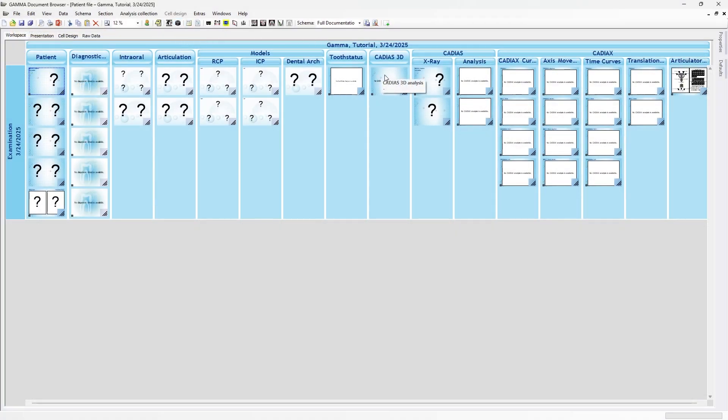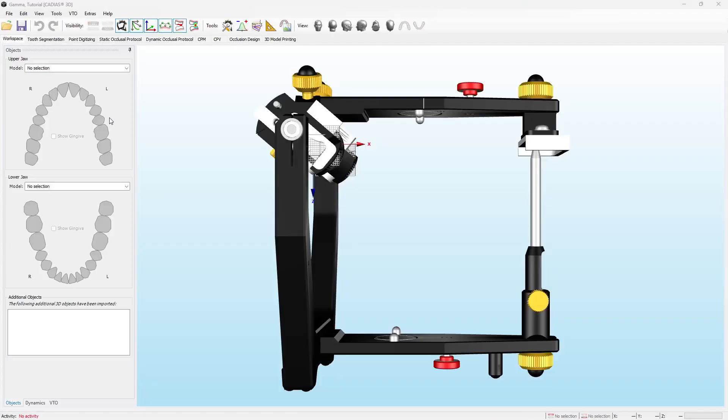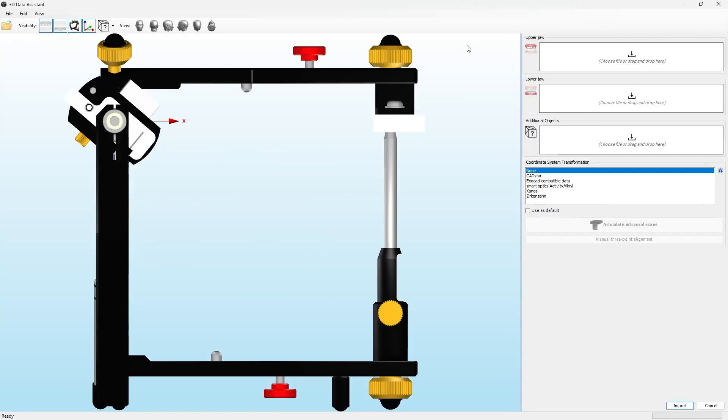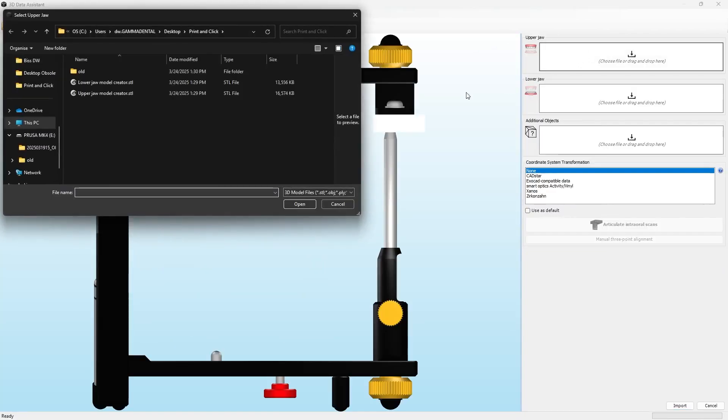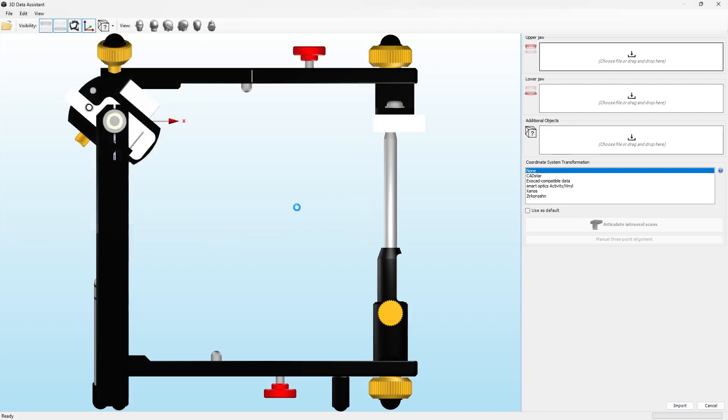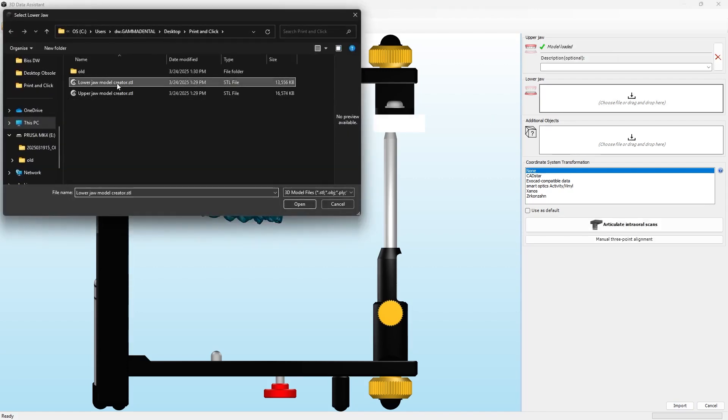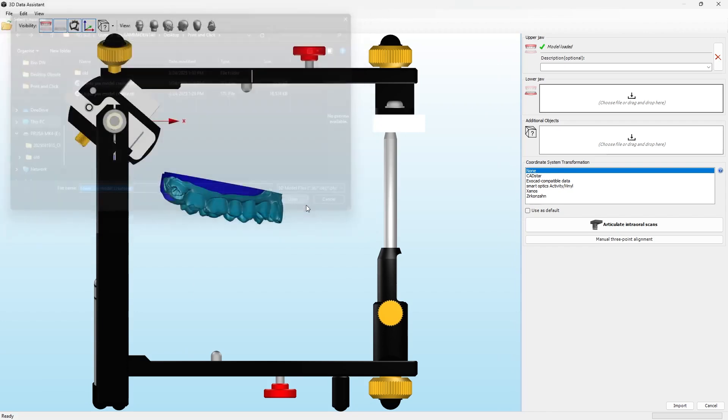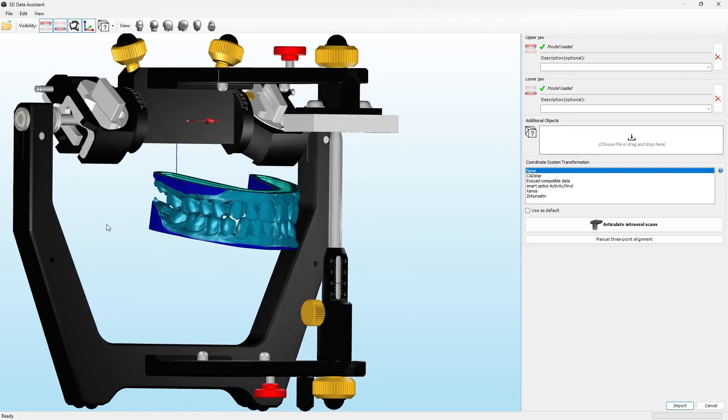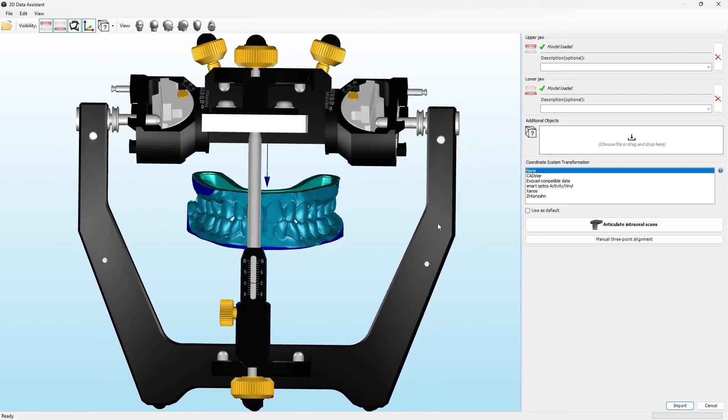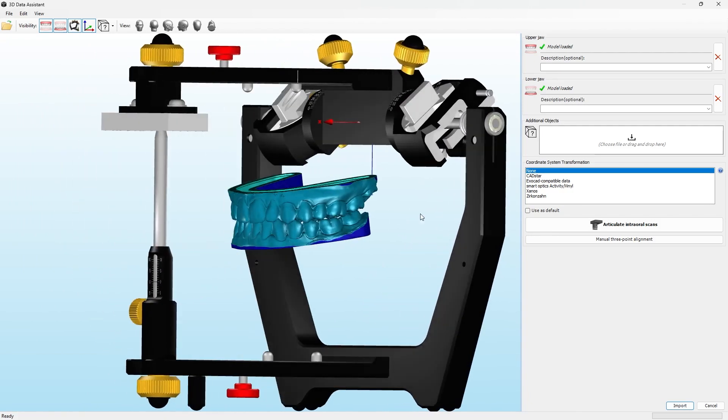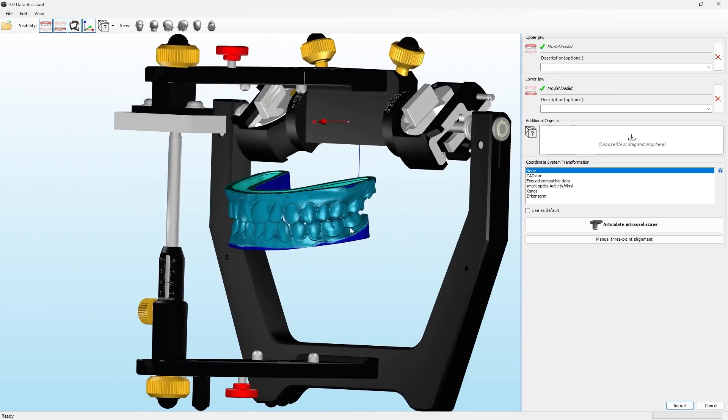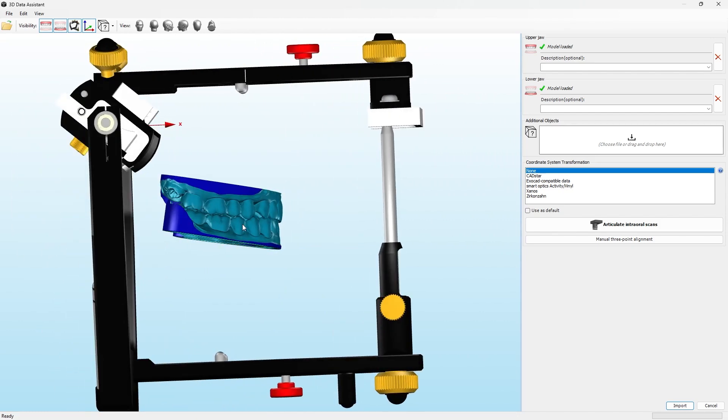After exporting upper and lower jaws, switch to Cadius 3D and import the models. If the models aren't yet articulated, you can proceed with articulate intraoral scans. In this case, the models are correct in the virtual articulator.